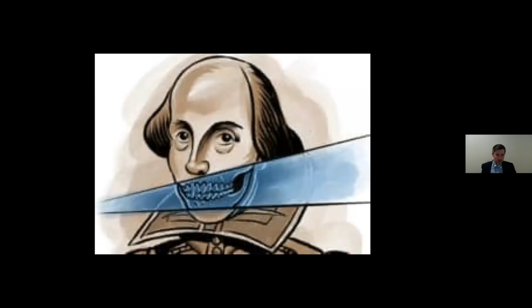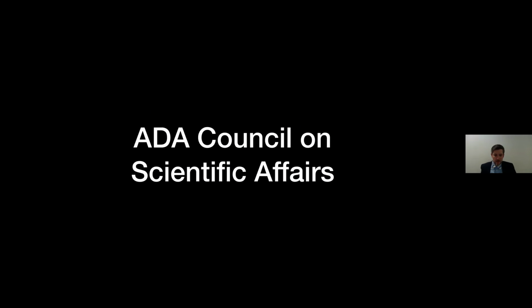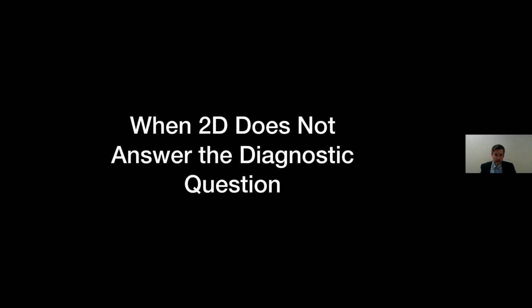So to close, the last question I'll leave you with, for the new cone beam owners, is to scan or not to scan. When do you use cone beam and when do you not use it? The ADA, the same article that I mentioned earlier that was sent out by the ADA at the beginning of the presentation, does answer that question.